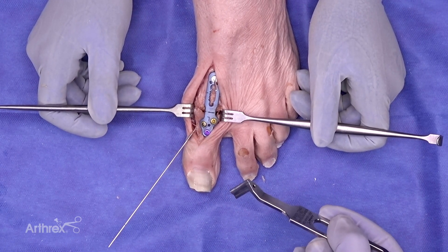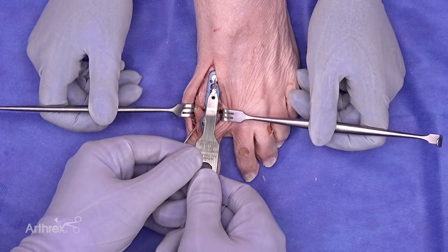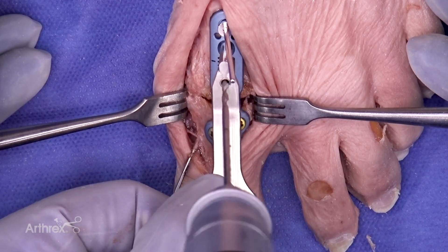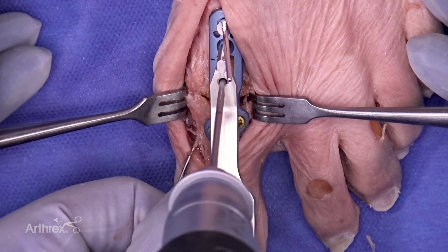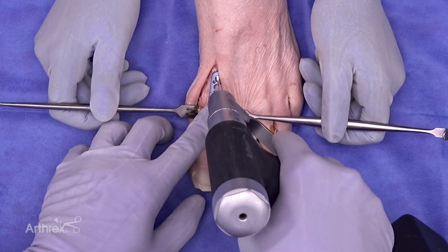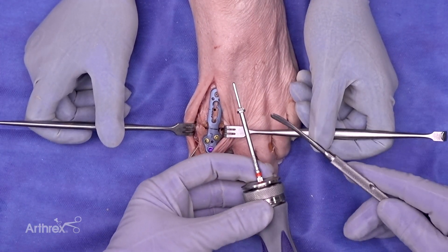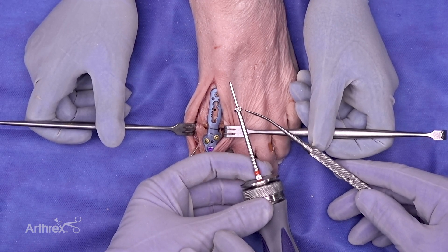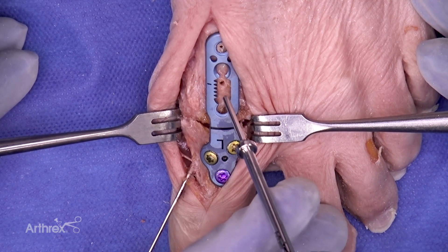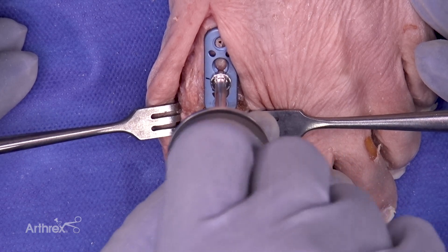This is the newly designed drill guide to provide the pilot hole for the geared mechanism. The solid portion fits into the oblong compression slot, allowing for a bicortical drill tunnel for positioning of the geared compression device. Prior to positioning of the geared compression device, remove the BB-TAC proximally and have your assistant prepare a BB-TAC for placement on the geared compression device. Note that the shoulder prevents pushing too far through the plate — make sure the shoulder sits against the plate prior to compression. Align the laser lines on the plate and the geared compression device for bicortical fixation.